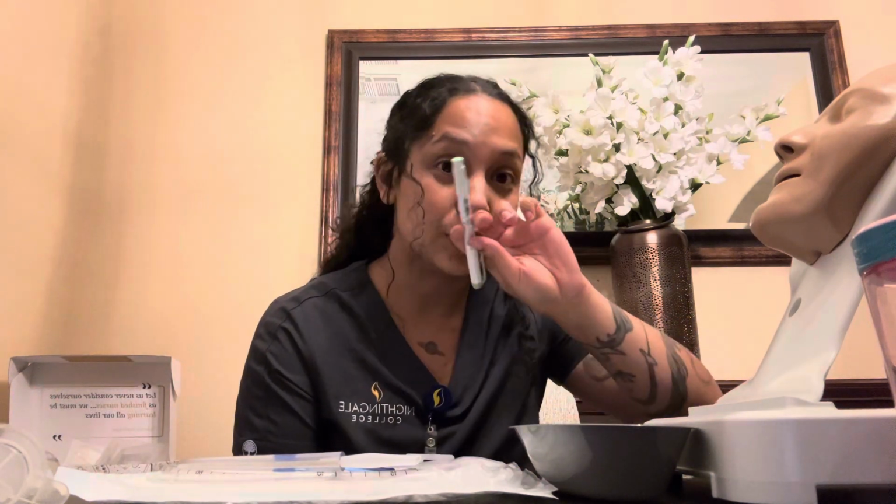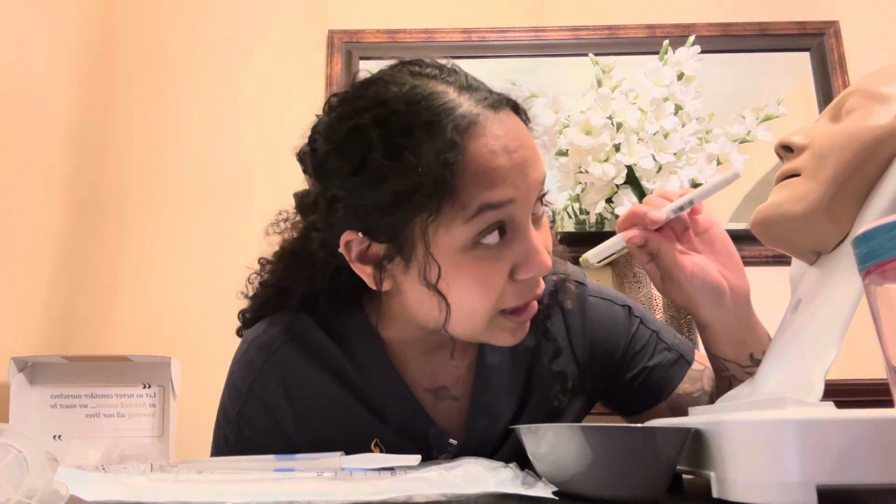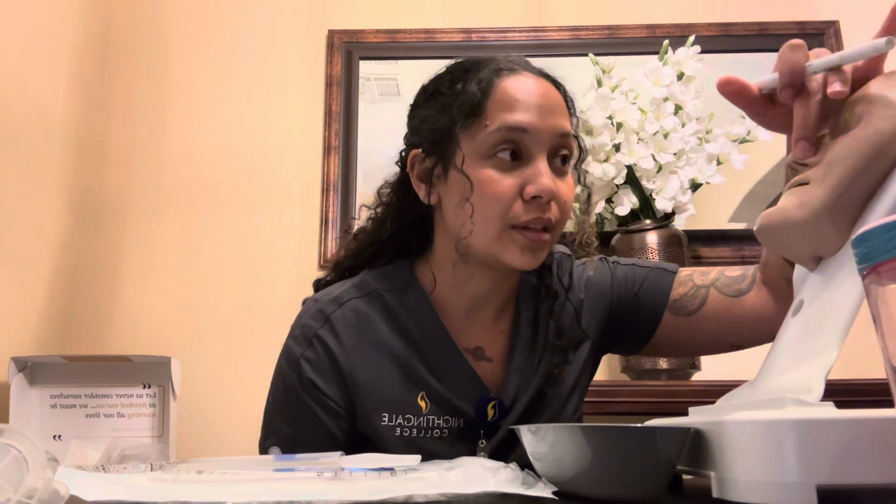Okay, let's go on. So before I go ahead and do the procedure, I'm going to inspect the nares and make sure there's no obstructions, no concerns or abnormalities that could prevent me from putting in the NG tube successfully and prevent her from breathing properly. So I'm going to ask her to look into her nose, and then I will inspect both sides. And along with that, I'm going to have her close one nostril, breathe in and breathe out. Breathe in and breathe out. Okay, so let's say her left nostril actually looks a little better and has better airflow. So we're going to go with that.